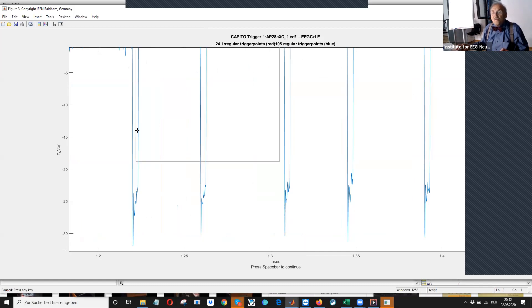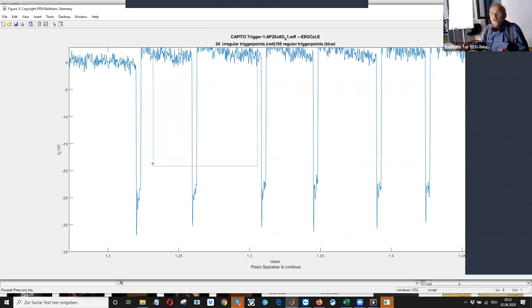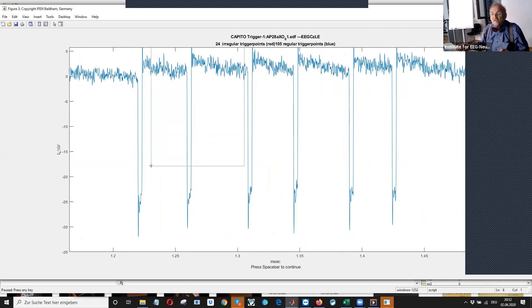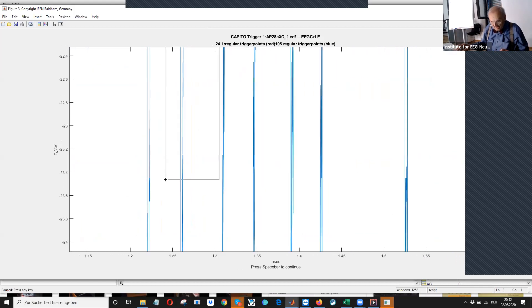So you, now you see, this is the regular trigger. Oh, sorry.